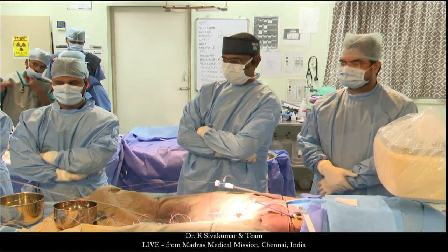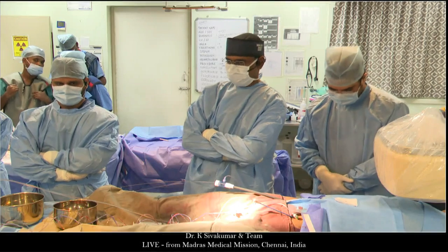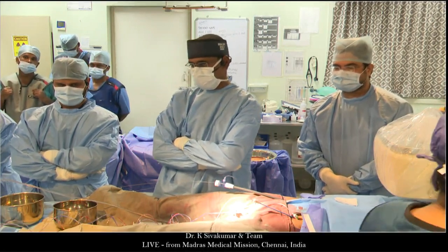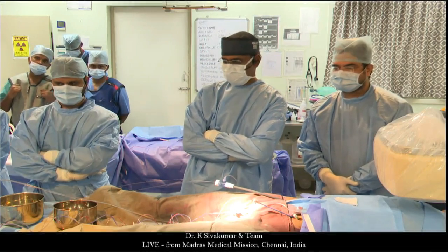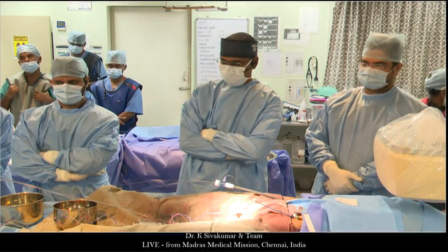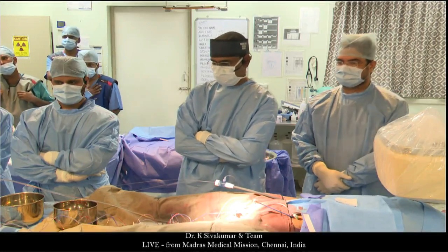I think the upper pulmonary vein is pretty small, so by MRI you can estimate how much flow is coming from it. Just don't occlude it. Okay. Dr. Jojo? Exactly, that's what we would do. We would discuss, of course, all these patients with our surgeons. So we think this is a team decision how to treat them, but we consider older patients for this treatment, and we would treat this patient interventionally as well. Thank you. We also do the same and we discuss the patients with the surgeons, and if the age and the weight are okay, then we go with either transcatheter or surgery.